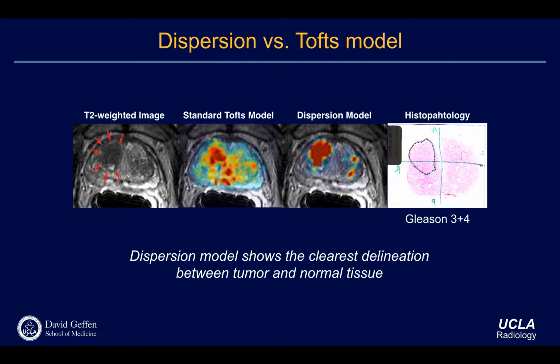To answer that question, I think this is still ongoing. People are looking at it. Particularly, the issue is, as you said, we're not sure how different it is across different patients, whether they have different input functions or not. So that's one, right? Person A versus person B. And also within person A, there's a normal tissue and a tumor tissue, and there's a difference between normal versus tumor tissue in terms of arterial input function.